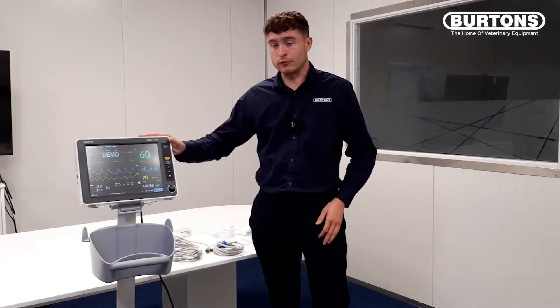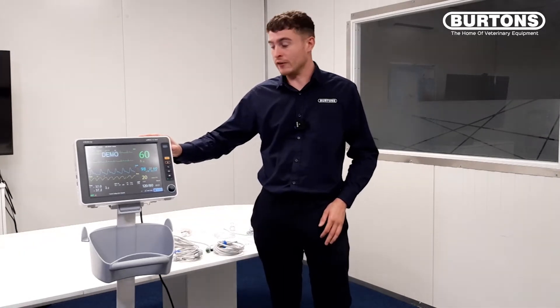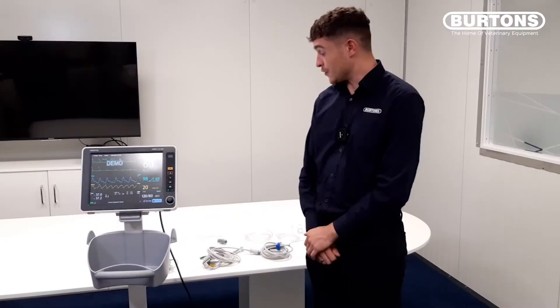Hello, my name's Liam from Burton's Medical Equipment and I'm going to do a walkthrough of the new UMEC12 multi-parameter monitor. This is the monitor that has superseded the iMEC8. I'd just like to talk about a few of the accessories that you get when purchasing the new UMEC monitor.